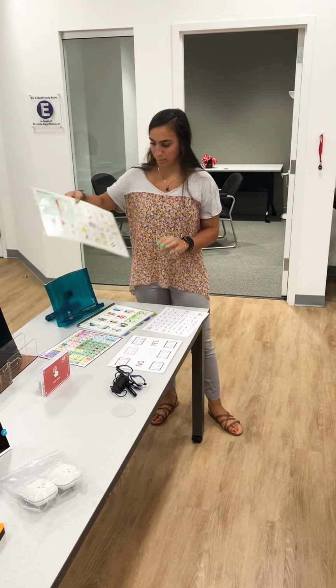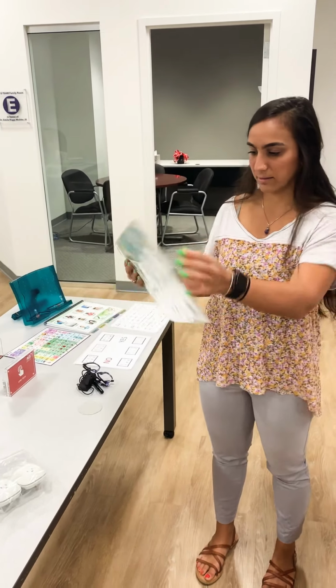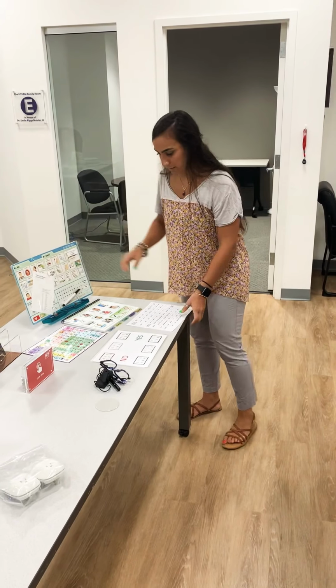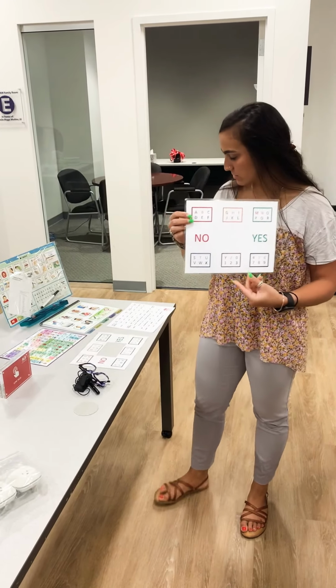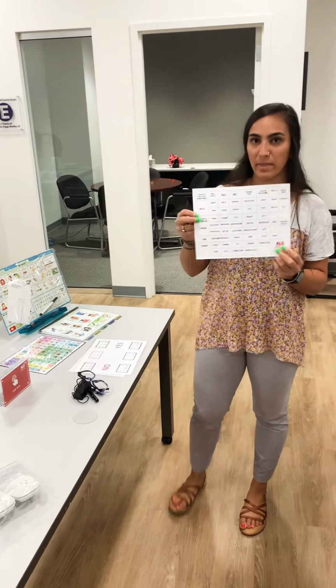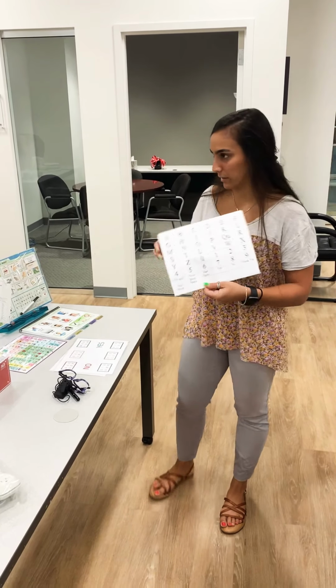Some of them are more medically related, like this one. Some of them are fairly simple, like this one with letters and numbers and yes or no. And you can make them as specific as you want them to be to tailor your needs for the things that you might ask for and need during the day.